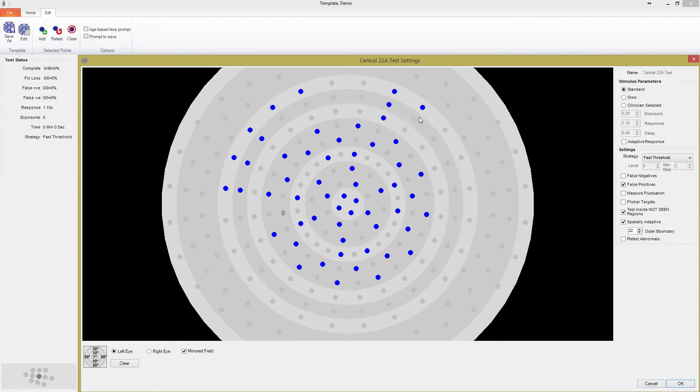If you want to start with a blank template, all you need to do is press the clear button in the bottom left corner.